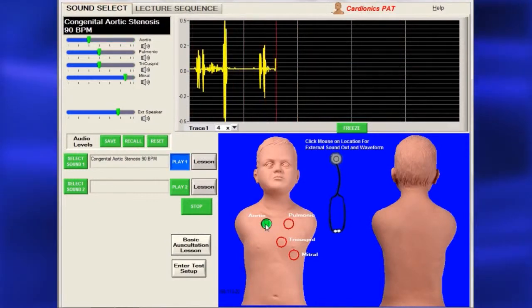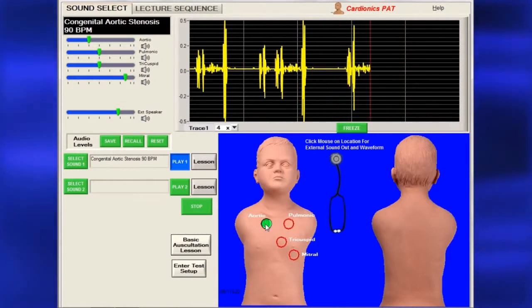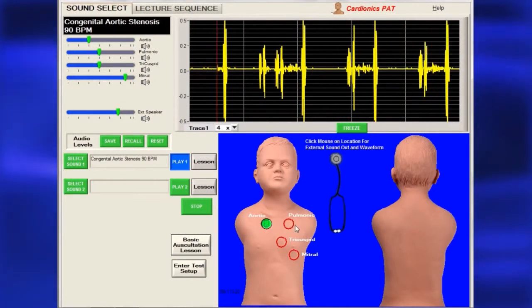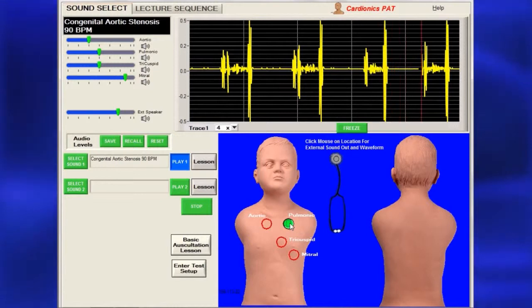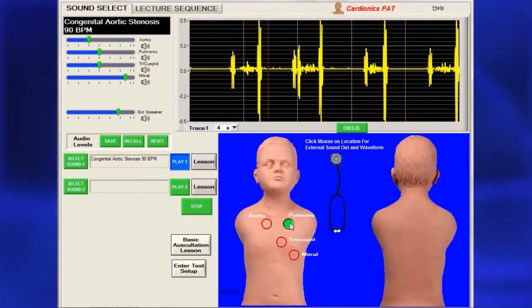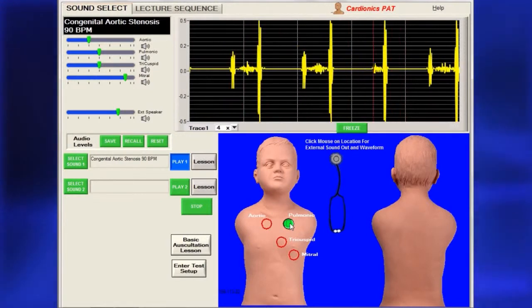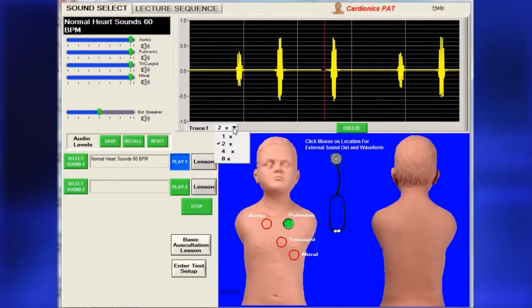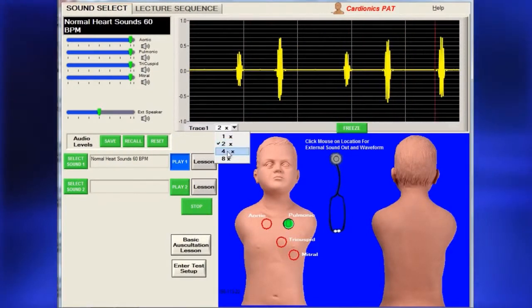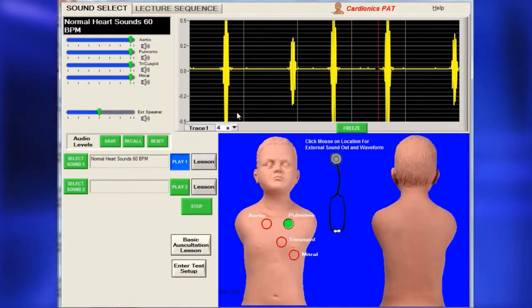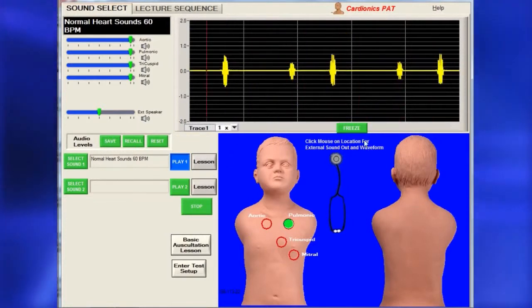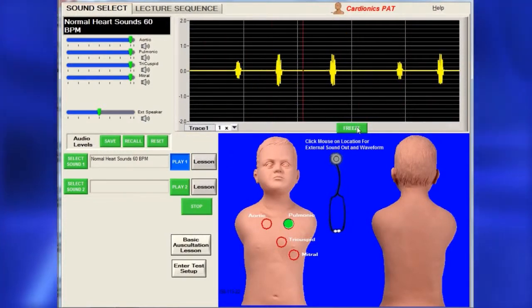To see a sound's related phonocardiogram or pneumogram on the screen while hearing it, click on one of the circled locations. The trace amplitude can be increased for better viewing or frozen for further study.